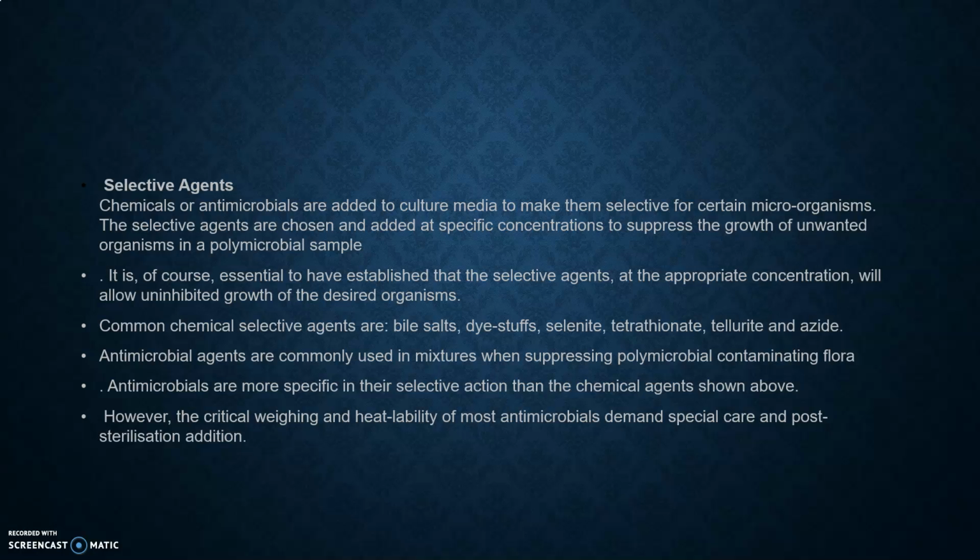Next, antimicrobial agents are also commonly used in mixtures when suppressing polymicrobial contaminating flora. So, antimicrobial agents are also added; they can be used as selective agents. Antimicrobials are more specific in their selective action than chemical agents. However, the critical weighing and heat lability of most antimicrobials demand special care and post-sterilization addition.